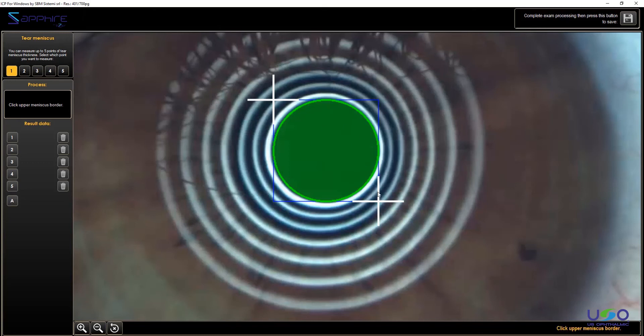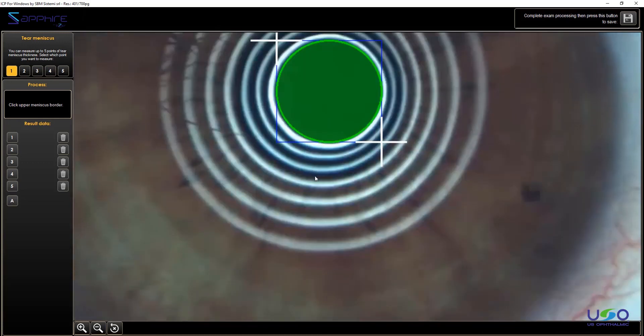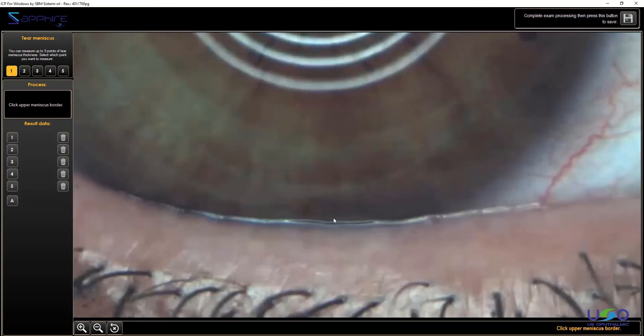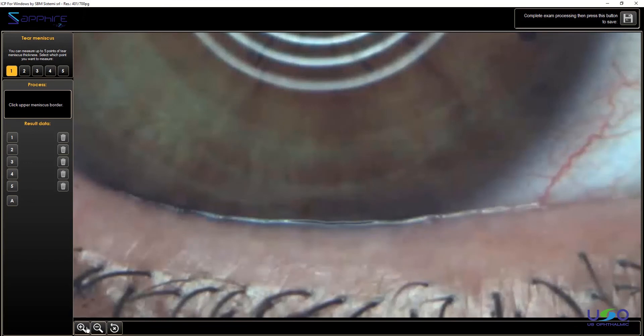So this tool is a calibration tool which allows a higher accuracy during the test analysis. After selecting the green spot, we just slide down the picture. Just remember you find the plus and minus zoom buttons on the bottom left corner. So once we are in this situation, we have just to follow the process suggestion.